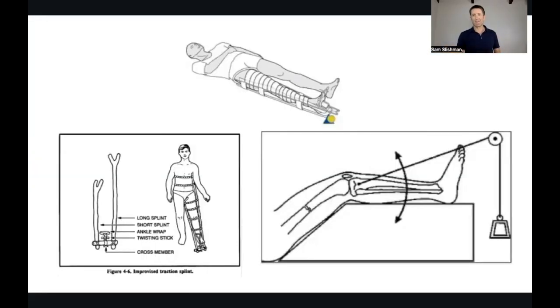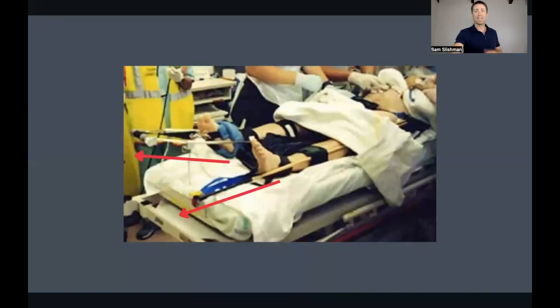This is what my textbooks had in them about femoral traction at the time. There's a picture of the Thomas splint. There's some improvisation with sticks. You can drill a pin through bone and hang weights. And then this is what, I took this picture, I think in 2002, perhaps. This just shows how far the Hare and the Kendrick splint extend past the foot.